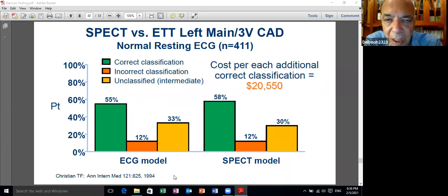السكريننج بوبيوليشن هو البولد كوهورت ايكويشن أو ان ايكويفالنت، لكن مش مع والاند بوينت بتاعتها myocardial infarction not mortality. لكن هنا في الديزيزد اندفيدوالز بقت قصه ثانيه الاكسرسايز اي سي جي. So exercise ECG should be used in the appropriate patient.